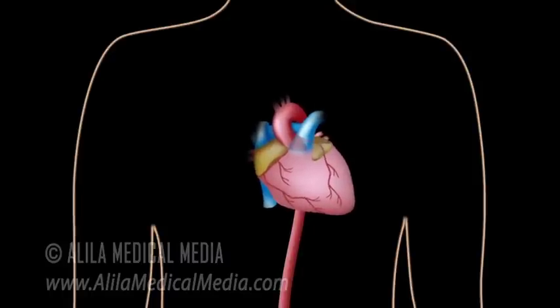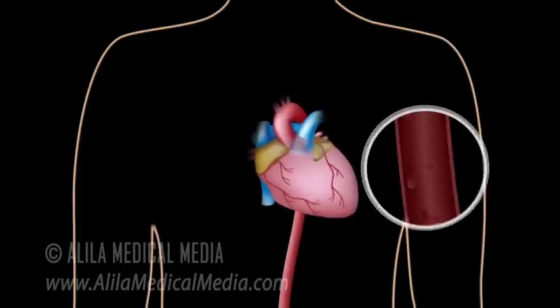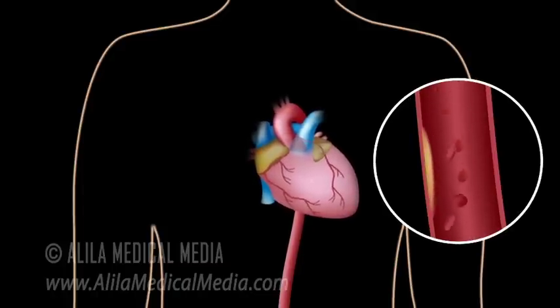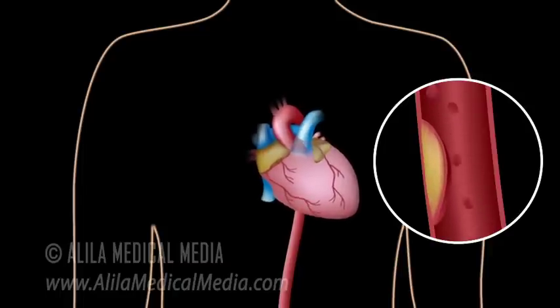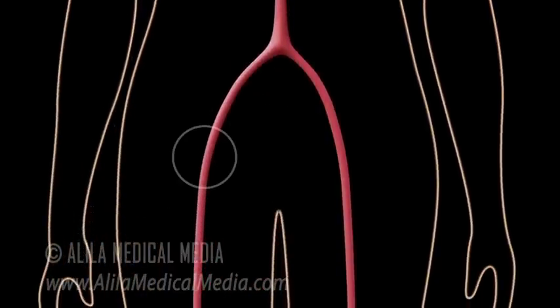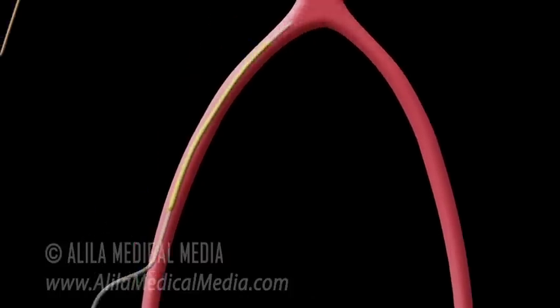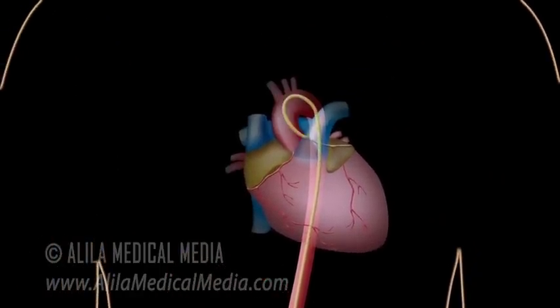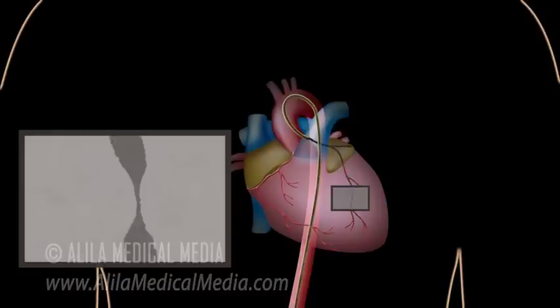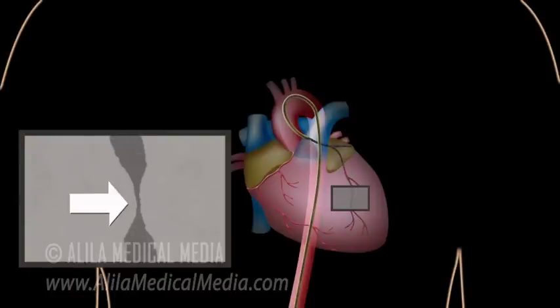Coronary angioplasty is a non-surgical procedure used to open narrowed or blocked coronary arteries. It can also be performed as an emergency treatment for myocardial infarction. The first part of the procedure is to localize the site of blockage — this part is called cardiac catheterization. A guiding catheter is inserted through the femoral artery at the groin and threaded all the way to the aorta. The tip of the catheter is placed at the beginning of the coronary artery to be investigated. A radio-opaque dye is injected through the catheter into the coronary artery, enabling real-time visualization of the artery using x-ray imaging. A narrowed part of an artery would appear as a bottleneck on an x-ray image. After the location of the narrowed artery is identified, angioplasty can begin.